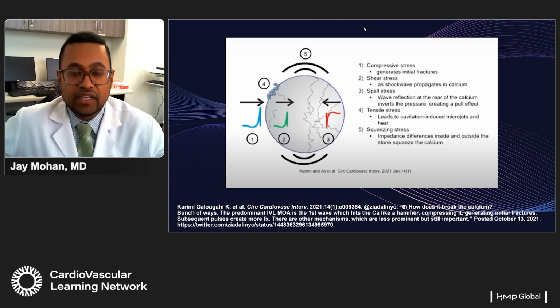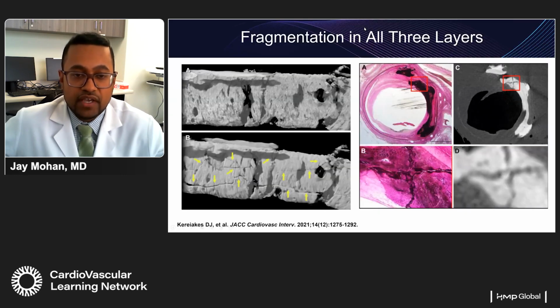And that's what's been really amazing. They've shown this in multiple different ways, but I think the best way is using micro CT, or microhistology CT, that shows, this is actually a cut from the superficial femoral artery. What was amazing when they first showed this was that not only are we getting calcification modification in a horizontal plane, but we're also seeing it in the longitudinal planes, in diagonal planes, and you're also seeing these chips or fractures of the calcium. So not only are you affecting the superficial, you're also affecting the deep. And you can see it here as well.